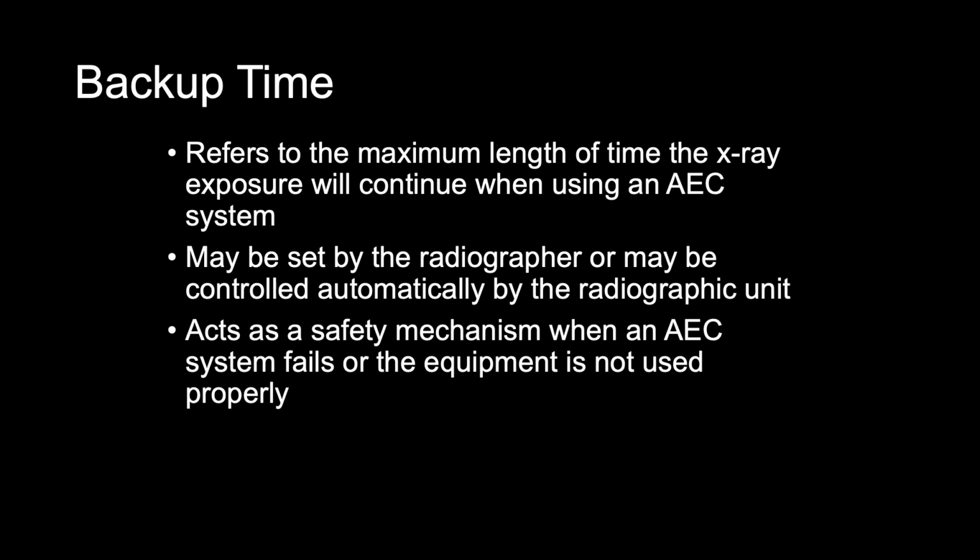Backup time should be set at 150% to 200% of the expected exposure time. This allows the properly used AEC system to appropriately terminate the exposure, but protects the patient and tube from excessive exposure if a problem occurs.